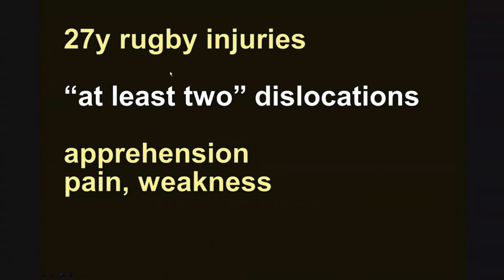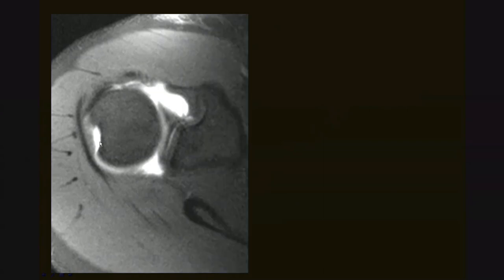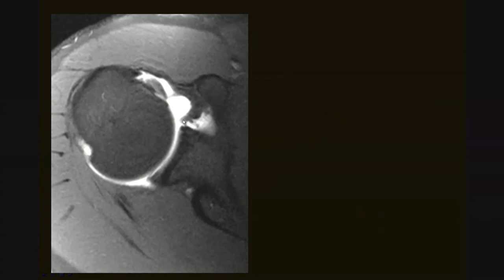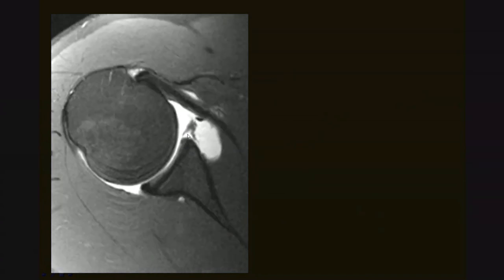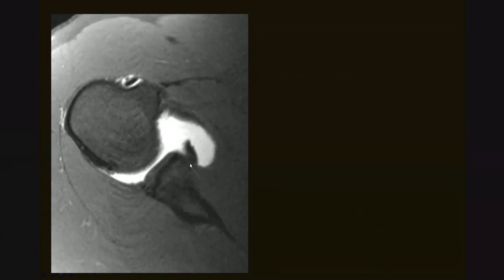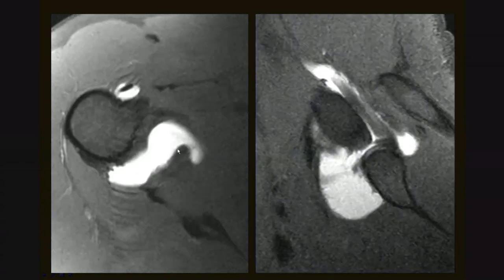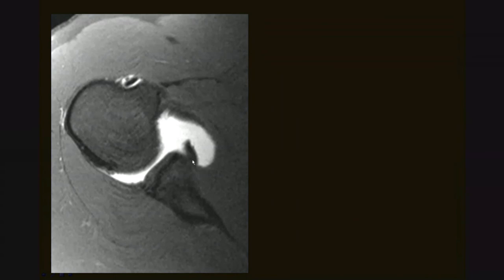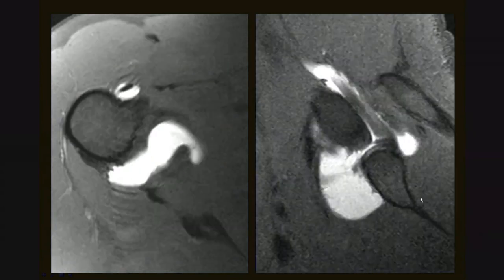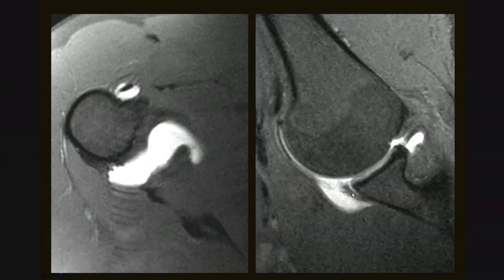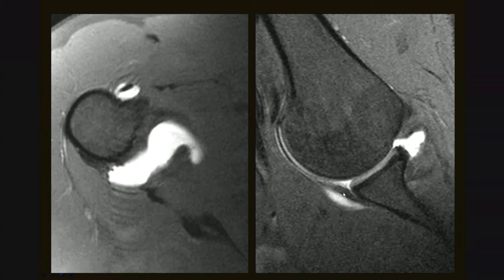Nearing the end — this is an individual who's had some rugby injuries and thinks he's had at least two dislocations. Based on physical exam he clearly has an unstable shoulder. Right away we see an impacted Hill-Sachs fracture. Here is the anterior labrum and the MGL. Following the labrum distally down to the glenoid, it is medialized — the IGL comes up and is attached to a labrum that's scarred down and displaced from its expected location. This is the so-called ALPSA lesion. On the ABER images, here is the labral tear, the IGL followed down to the labral attachment site where the labrum should be but is displaced medially — this is capsular and periosteal stripping. A medialized labral ligamentous complex: classic ALPSA lesion.